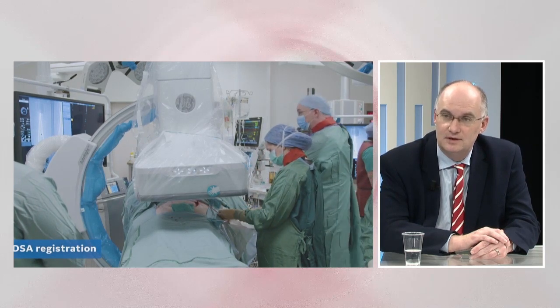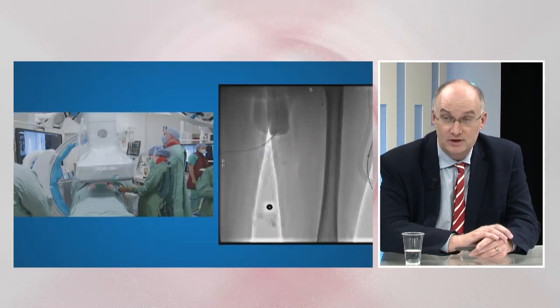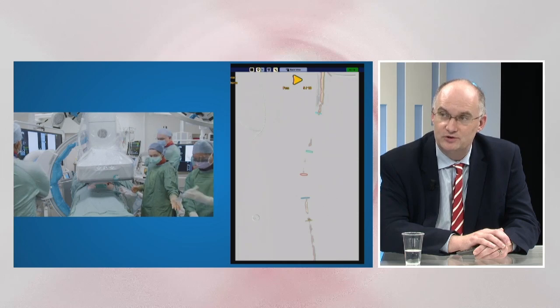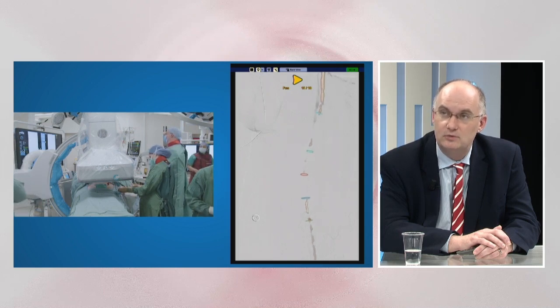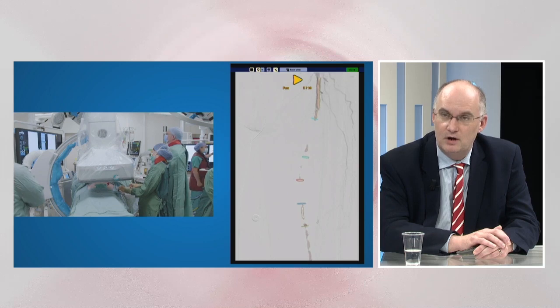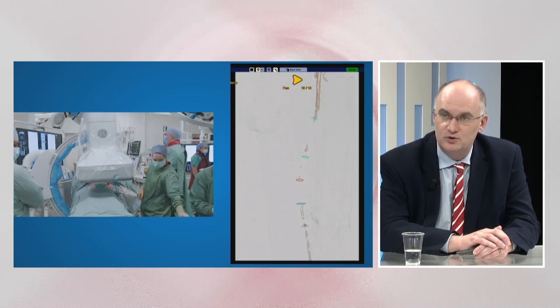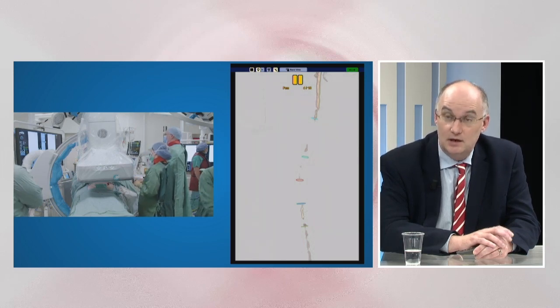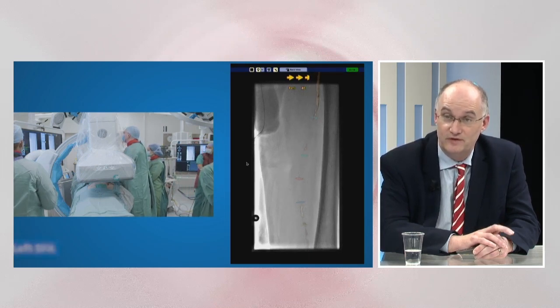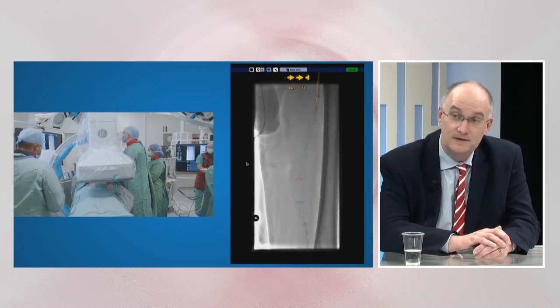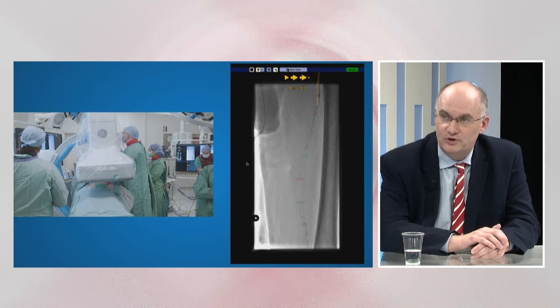The lower limb arteries are not as mobile as the thoracic aorta, so registration was slightly easier. You can now see our target arterial pathway from the pre-op CT being overlaid to guide us and help us be confident the wire is going where we want during these two sub-intimal angioplasties. We did shoot an initial angiogram — very early in our Alia experience, we're already talking about tackling these with no pre-operative angiogram. With a tiny adjustment we felt spot-on with the registration before embarking on wiring down the occlusion.